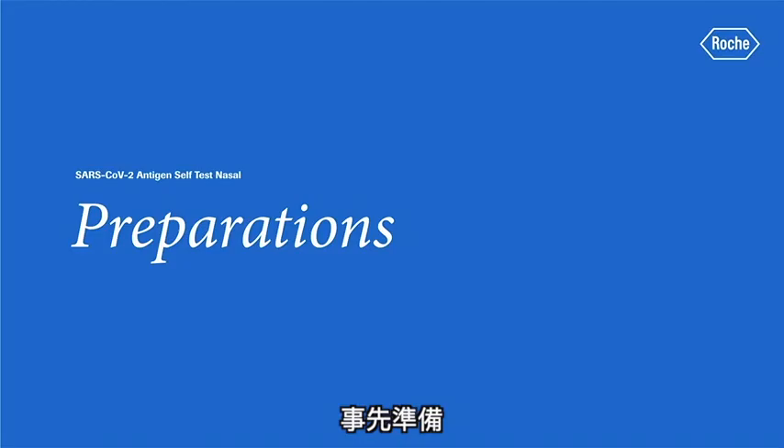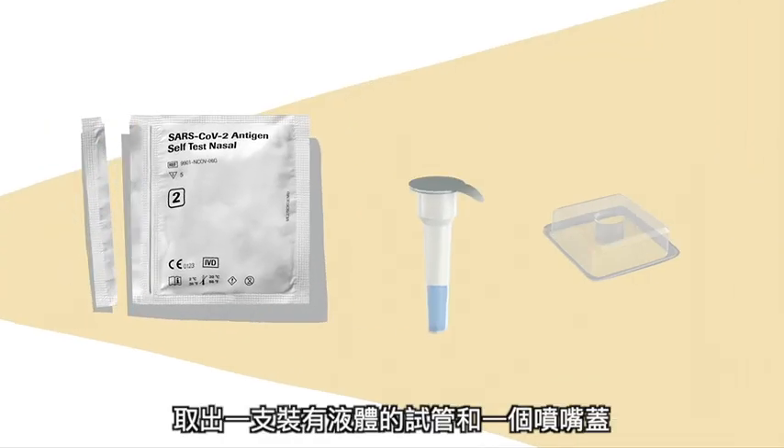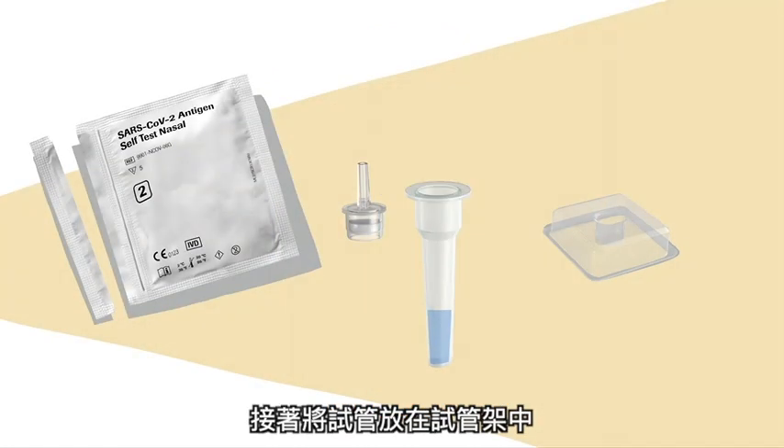Prepare for sample collection. Now you can open foil pouch number 2. Take out one of the tubes with the liquid and one nozzle cap. Open the seal of the tube carefully without spilling the liquid inside the tube. Place the tube in the tube holder.